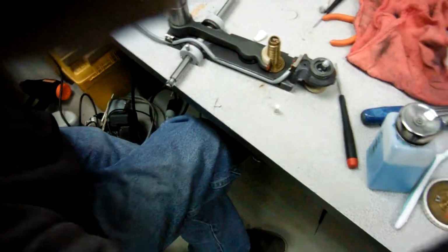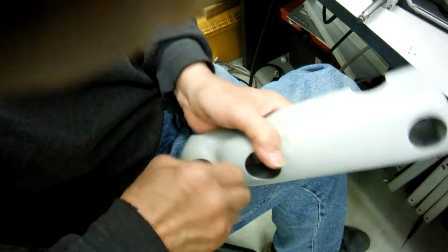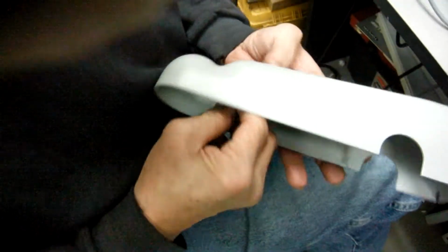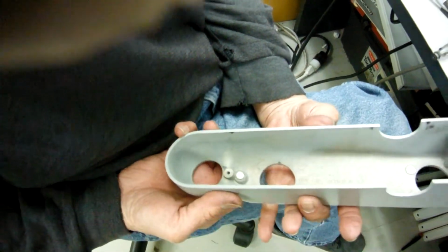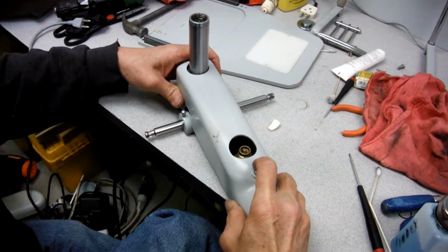Alright, also you need to clean the inside of here. Use the lighter fluid and clean inside the hole, so that makes your push button move quickly and easily, and just drop it in there like that. And when you drop it in there, you use your finger to hold it, kind of pull it back there so it stays, and then you can put the cover back in place.